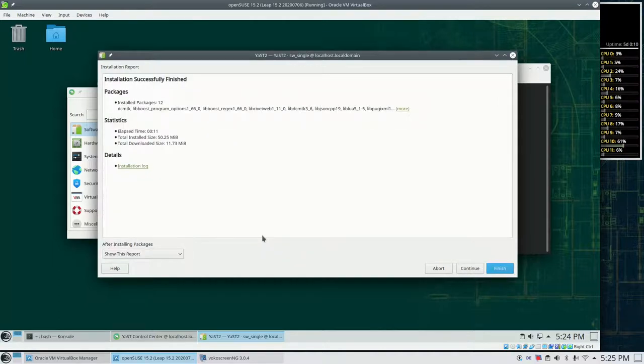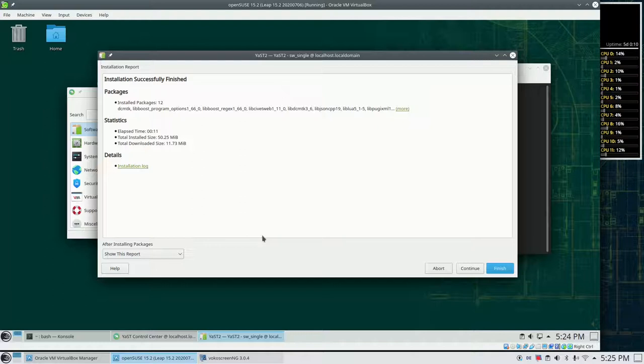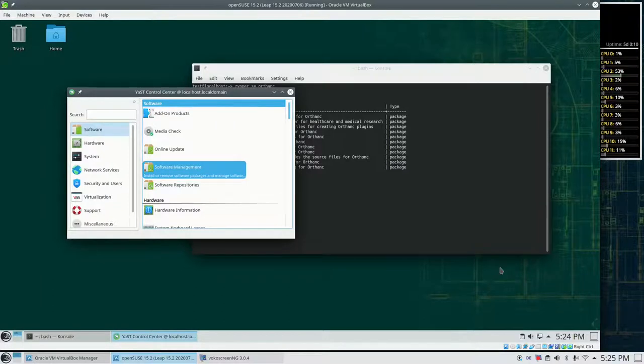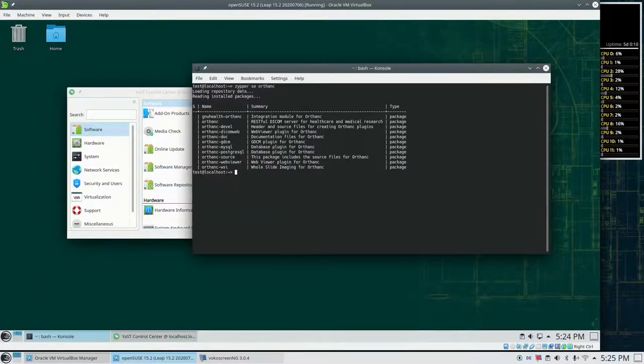So that was it already. The whole installation took us about 11 seconds. I finished this. What can we do now?